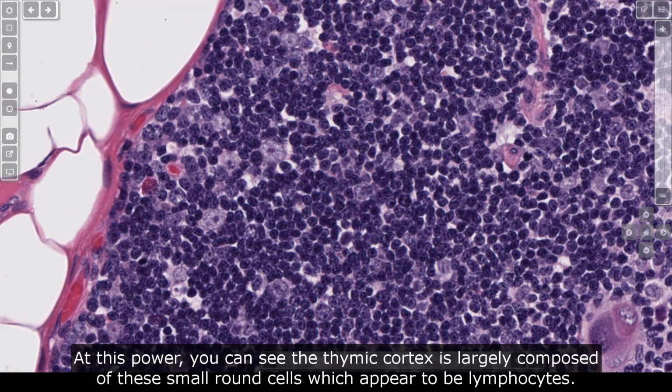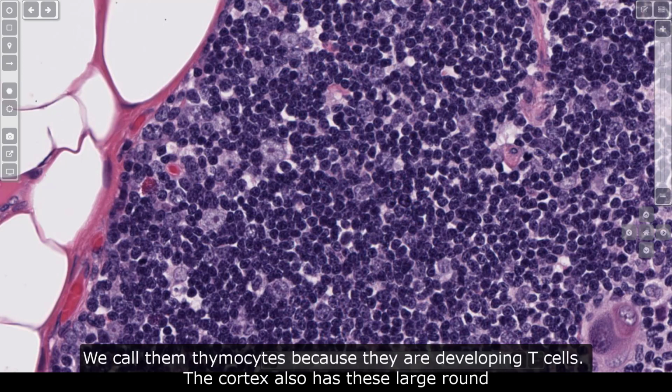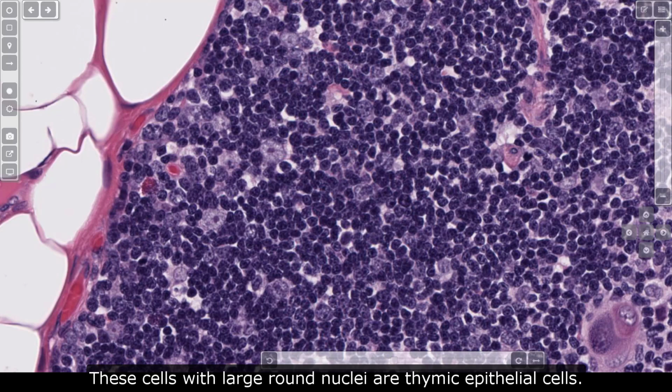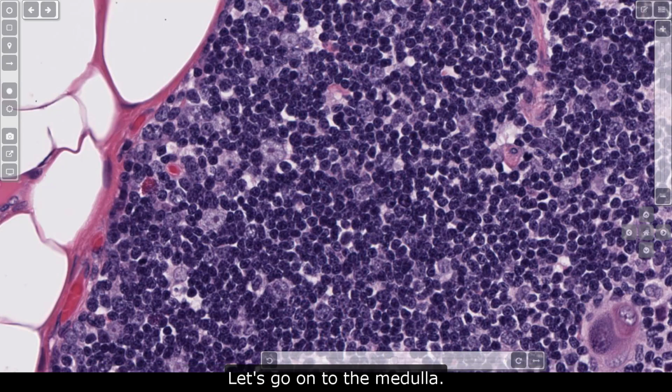At this power, you can see the thymic cortex is largely composed of these small round cells which appear to be lymphocytes. We call them thymocytes because they are developing T cells. The cortex also has these large round nuclei with nucleoli, like this cell right here and another one right here. These cells with large round nuclei are thymic epithelial cells. Let's go on to the medulla.